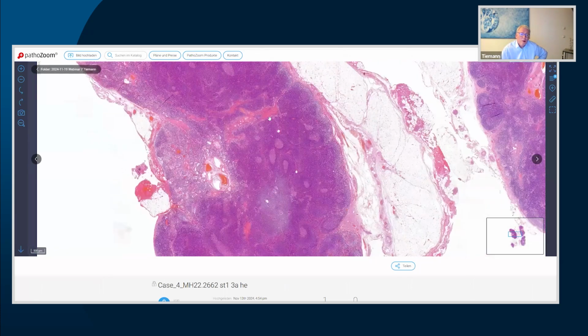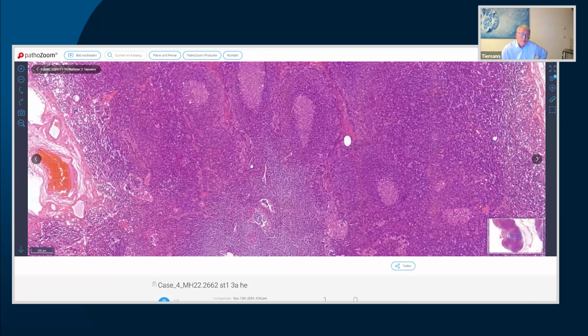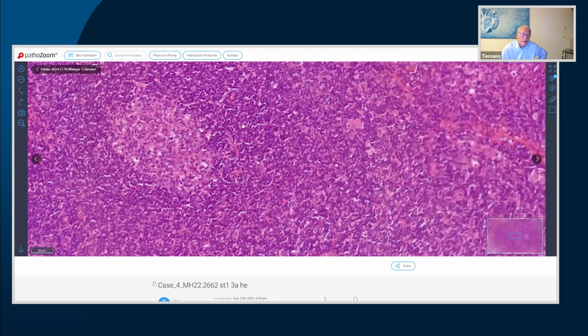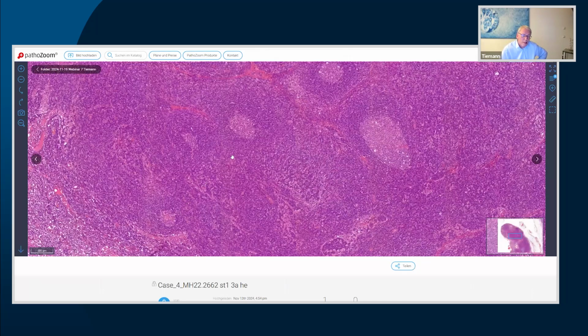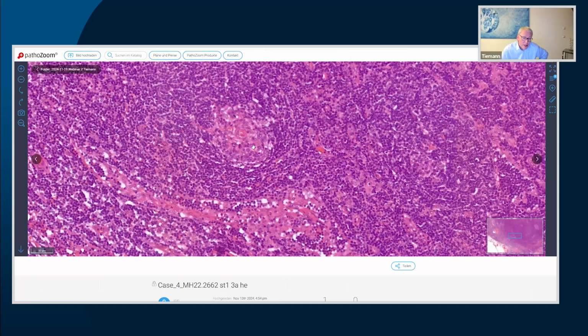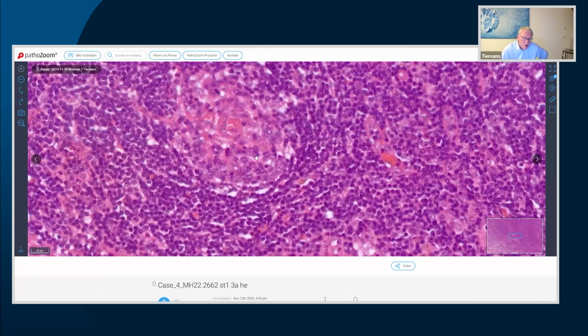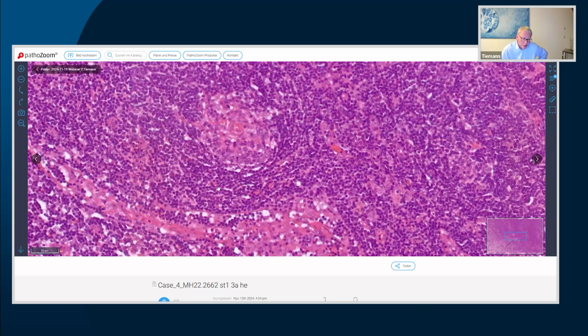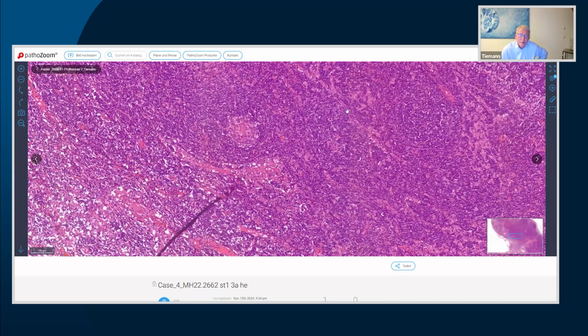This is the overview. Larger germinal centers. And then here, a diminished number of blasts. And this seems to be in a germinal center with some onion layers and thickened walls of vessels. And in the interfollicular area, an increased number of venules, high endothelial venules. Here again, at first, we look again for CD20.